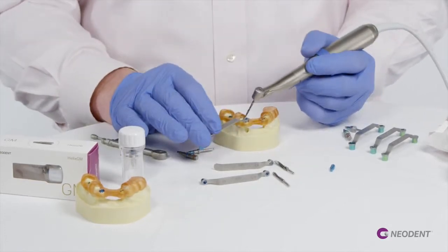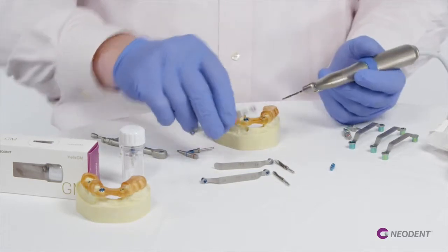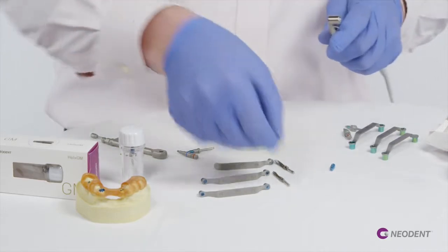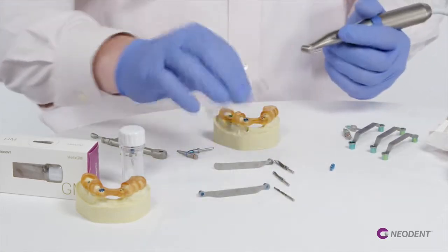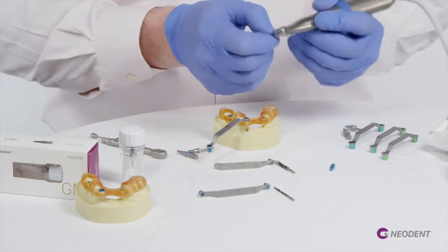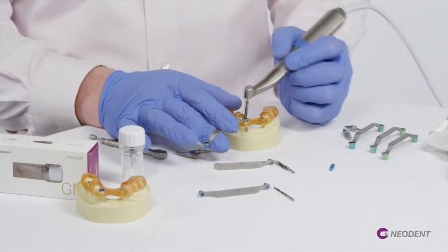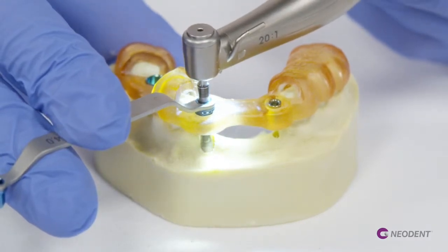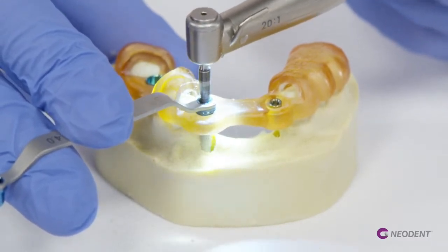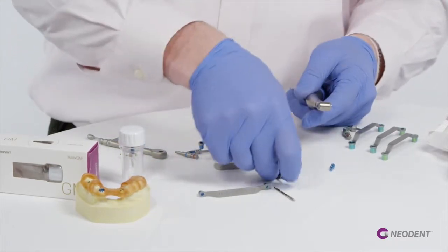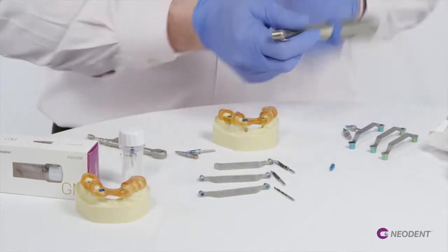Our first drill is that 2 millimeter twist we took down to 11 and a half. Now we transition to our second drill. Just like our conventional kit, we're going to the 3.5 diameter drill. I'm going to place this into my handle, passively fit this down into our spoon, and start our osteotomy. It's really good if you can do a pumping motion that gets water irrigation down along the side of our drills to keep those drills cool and not heat or necrose the bone.